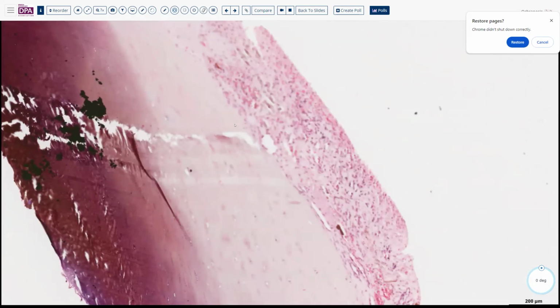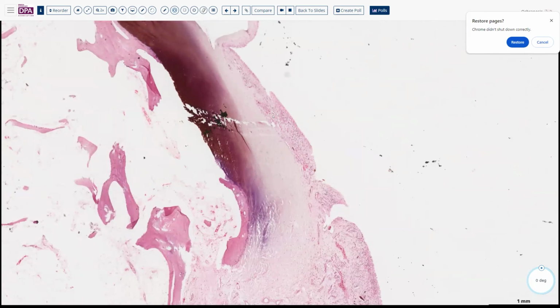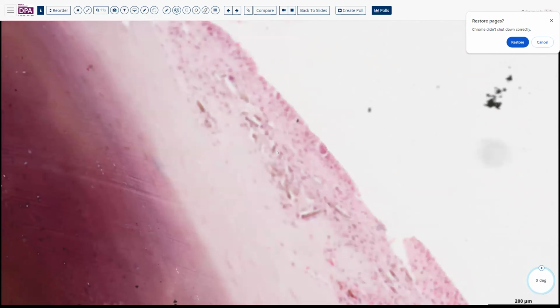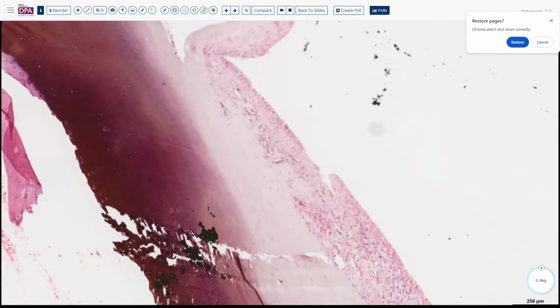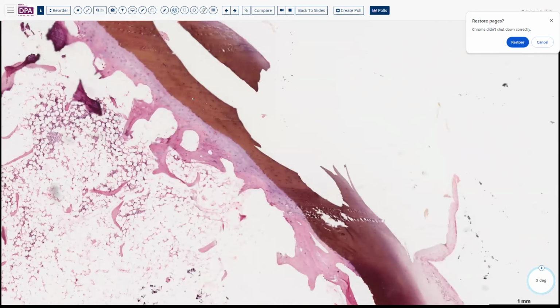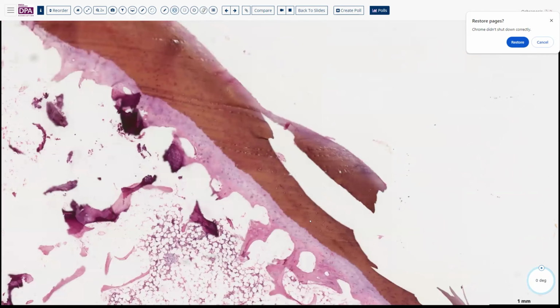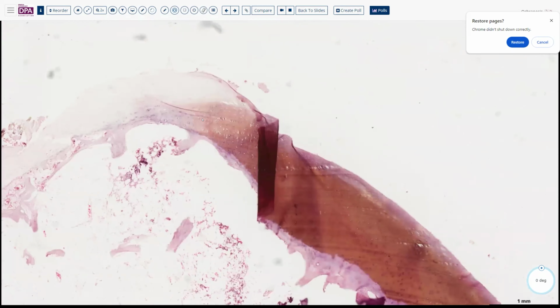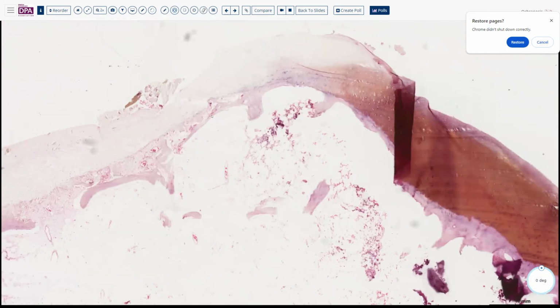We don't see similar discoloration here in the synovium itself, although maybe you can see here there is a little bit of pigmentation there. It's not well into focus there. But there in the borders of the tissue, you see some of that change. And it's not altogether uniform everywhere, but certainly very pronounced.